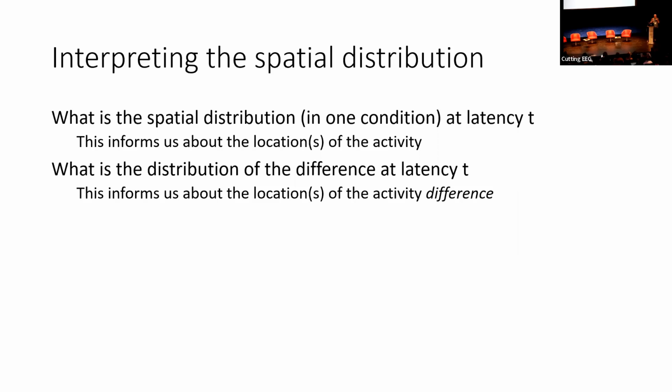Then you can start thinking about, okay, so looking at ERP difference waves, the topography allows you to localize the area in the brain responsible for facial processing, or that is selectively sensitive to spatial processing. It's probably not one region, but multiple regions, but it allows you to zoom in on a specific thing without having to look at all of the activity at the same time.